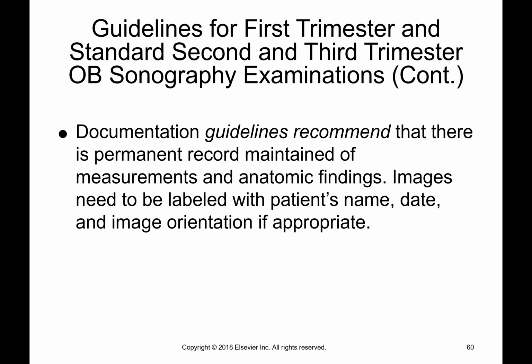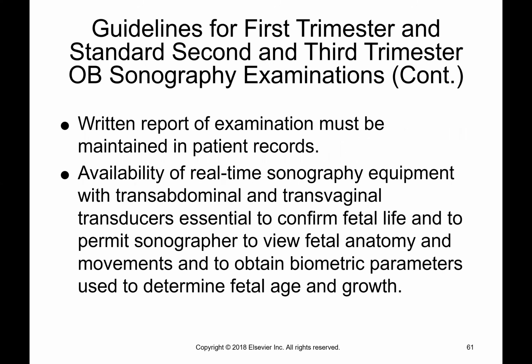The documentation guidelines recommend that there is a permanent record maintained of measurements and anatomic findings. Images need to be labeled with the patient's name, date, and image orientation if appropriate. The written report of the examination must be maintained in patient records.